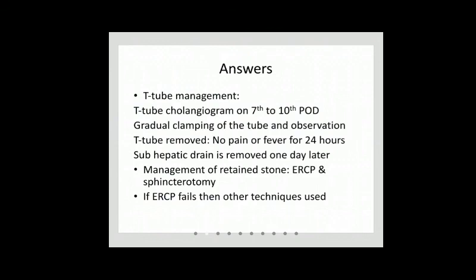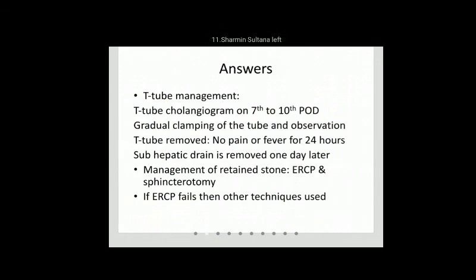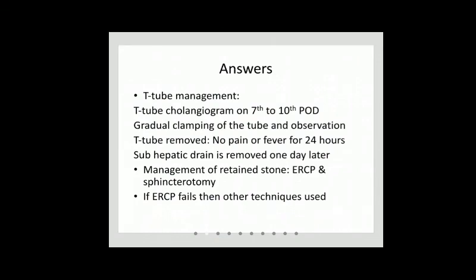If you put a T-tube after surgery, we go for a T-tube cholangiogram on the 7 to 10 postoperative day. If there is no residual stone, then we remove the T-tube within 10 days of surgery. Clear? Yes, sir. So any question regarding obstructive jaundice?